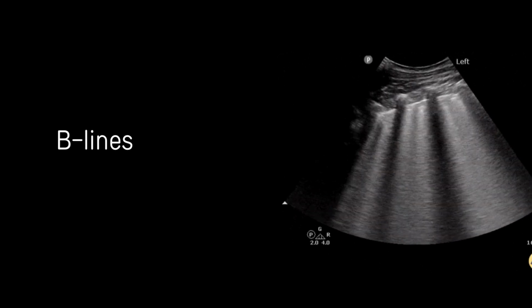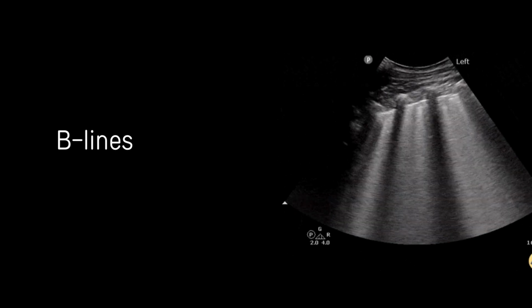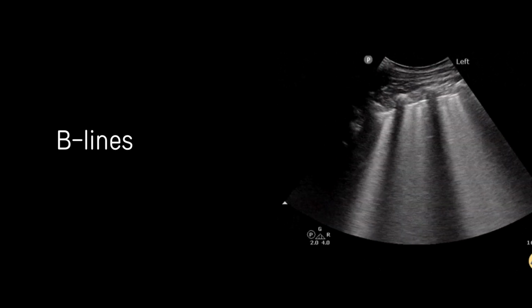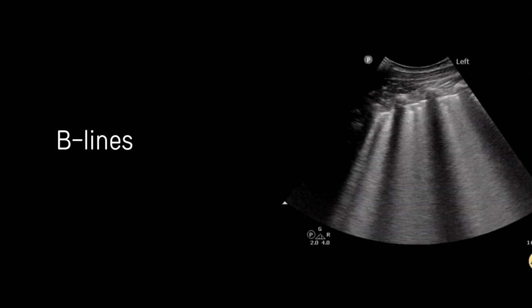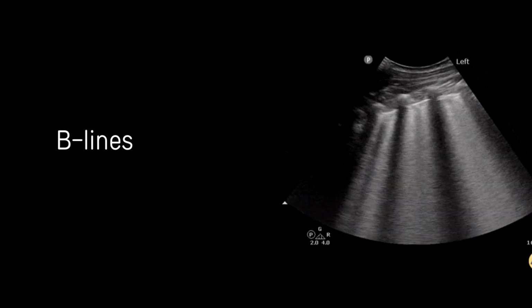Okay. Now, if you think about your patient, B lines aren't that uncommon, even when they don't really have significant pathology. It's like the bases, the dependent part. So usually there's a little bit more interstitial fluid than it would be at the apices. But if you've got B lines everywhere, then that gives you information versus B lines just on one side. Then you've got to think infection rather than pulmonary edema.